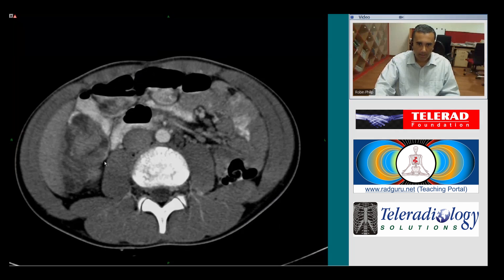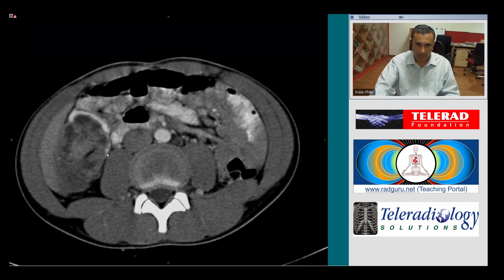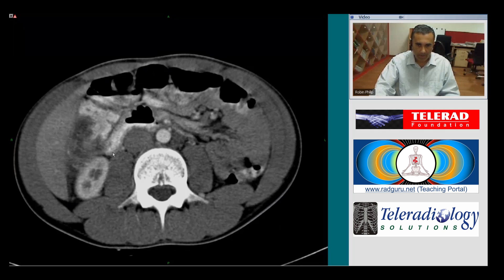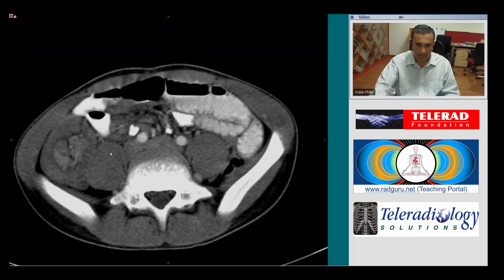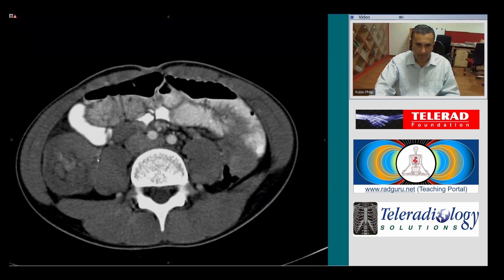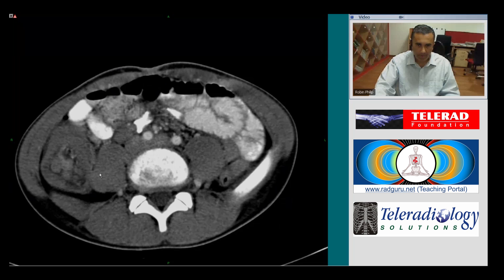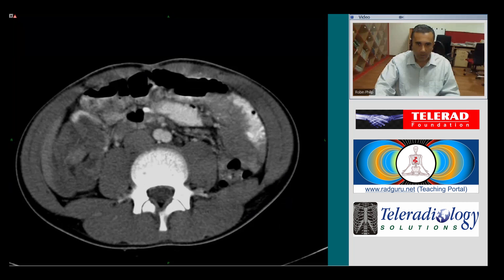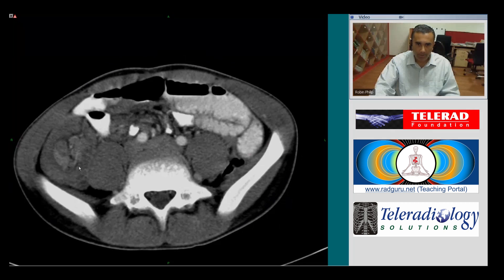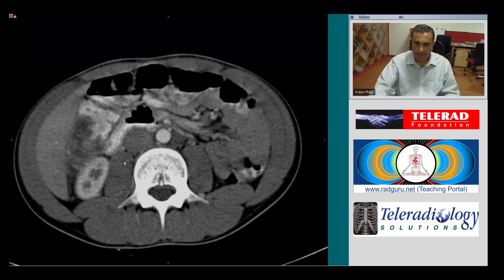In this case the intussusceptum is somewhat edematous and thickened, which indicates that this intussusception has probably been around for a while, with some edema of the intussusceptum. There are also some small polypoid soft tissue densities here, which could potentially represent lymph nodes that have prolapsed along with the terminal ileum and mesentery into the colon.